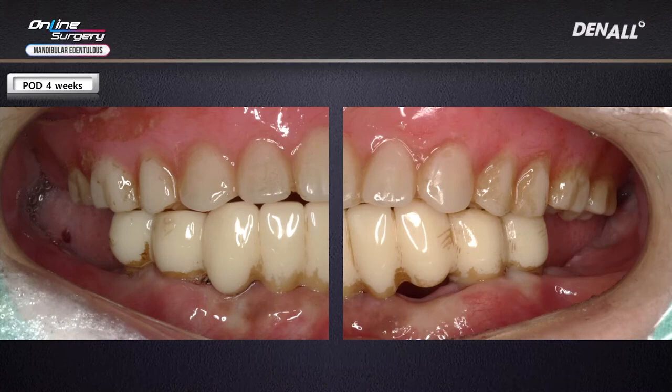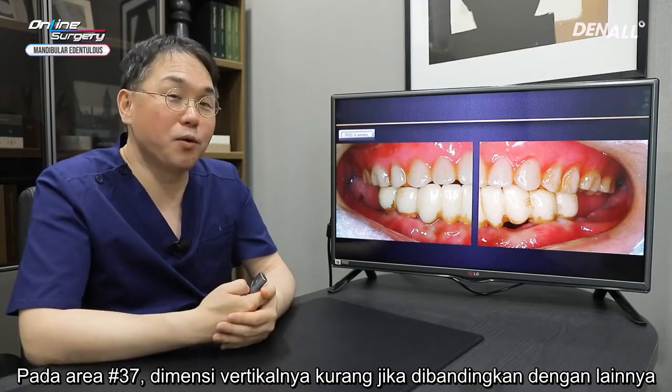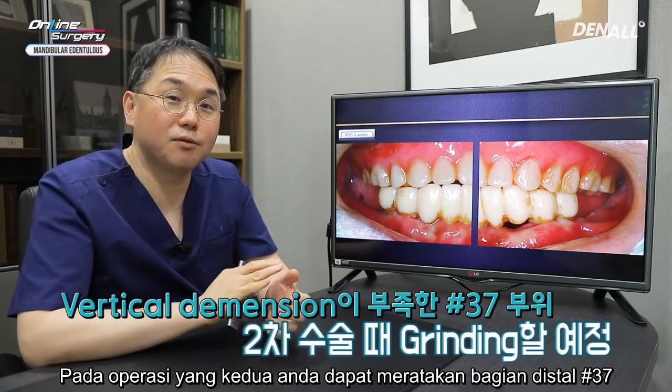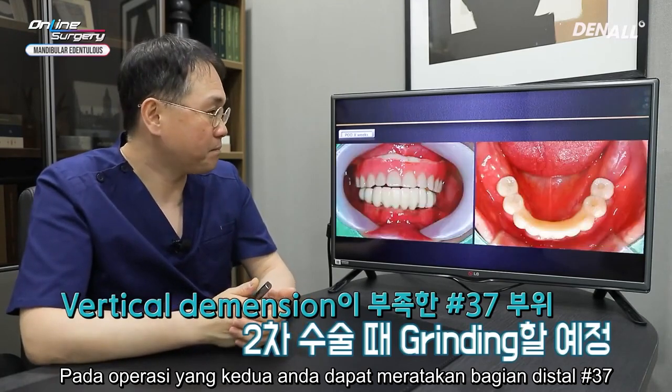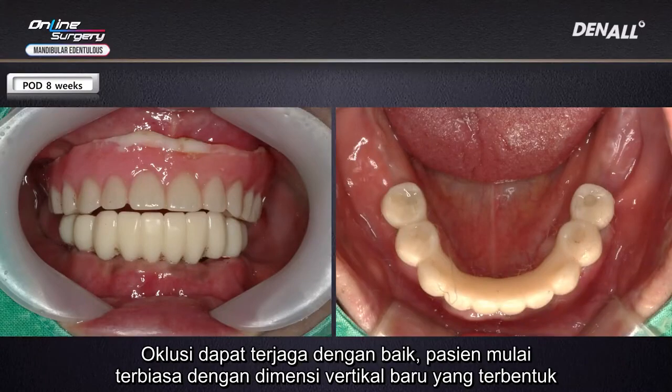You can see that it has been secured. On number 37, the vertical dimension seems lacking comparatively. In secondary surgery, you can grind the ramus distal to number 37. This is follow-up at the 8th week. Occlusion is well maintained. The newly formed vertical dimension, the patient has become accustomed to it and is masticating well.